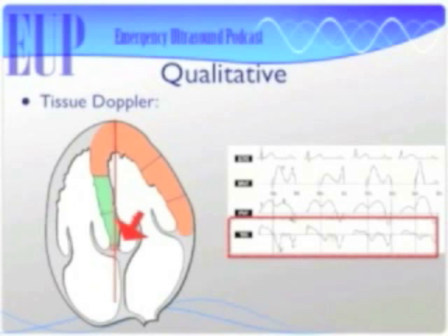Correct. Got it. So you could pretty much just do tissue Doppler on your patients, and if it's normal, you're done. And if it's not, then you take a look at the mitral valve inflow and figure out exactly how abnormal is it. Perfect. You like it? Yep. All right, we're doing good. So there we are. There's our TDI right there.